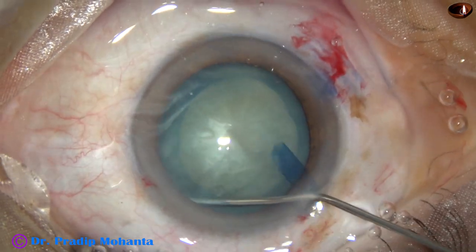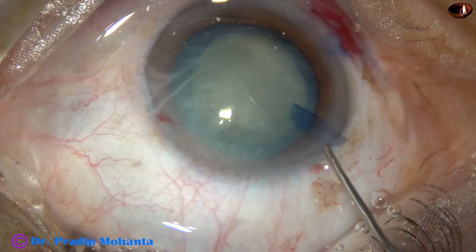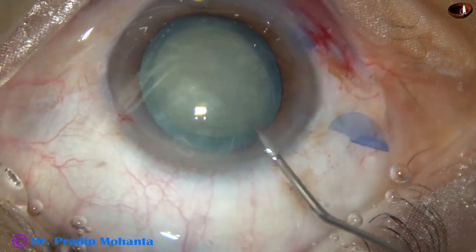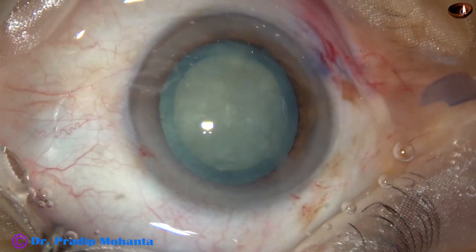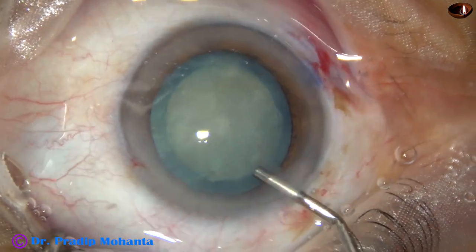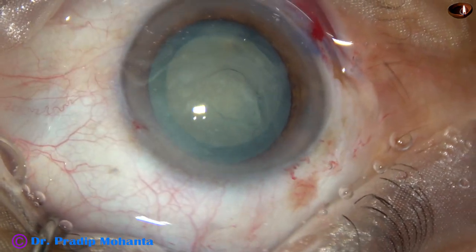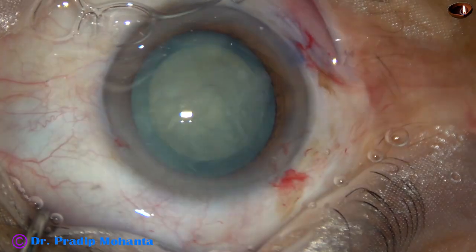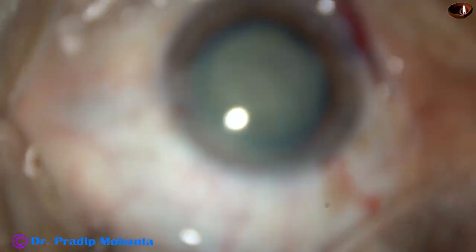Hydrodissection is then done. The nucleus is stabbed and then rotated. Viscoelastic is again injected and then this is the time for introduction of the phaco needle.